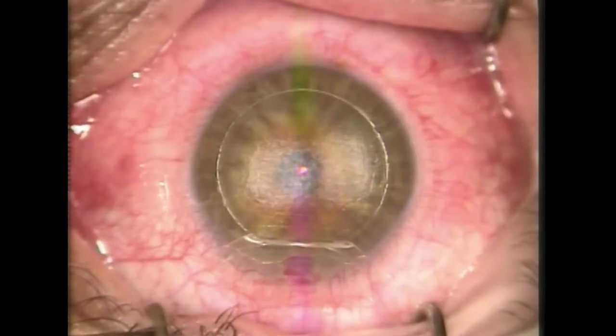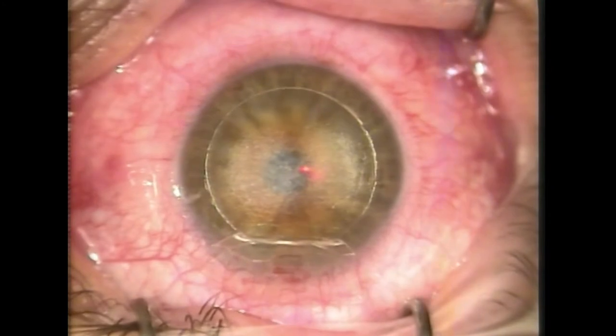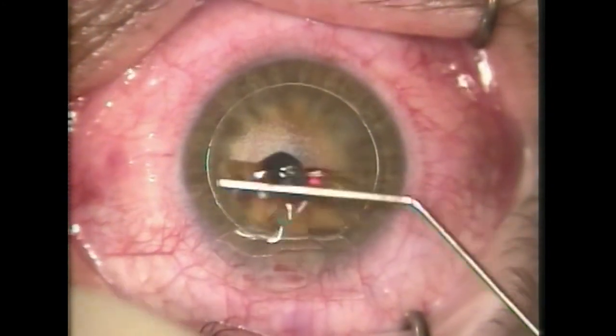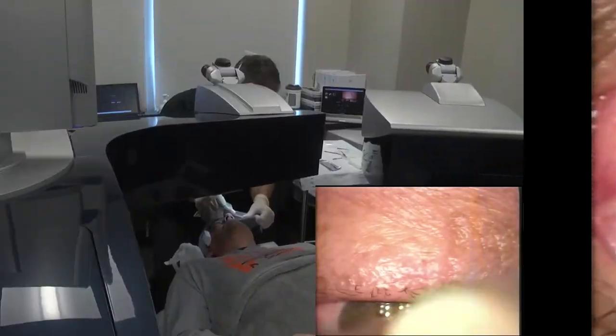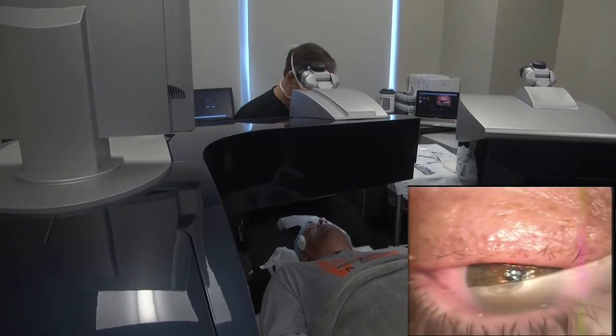Just keep relaxing. Don't worry about the laser fumes or anything. Just keep holding still. You're doing beautiful. Here's some drops. I'm going to put this little drape on the eyelashes — just helps keep them out of the way.